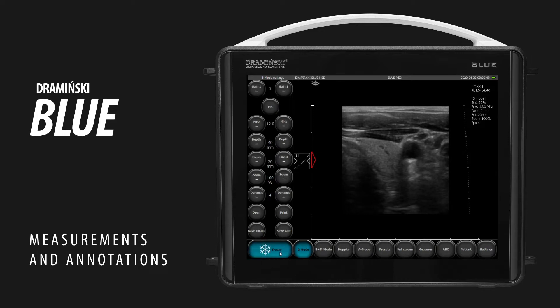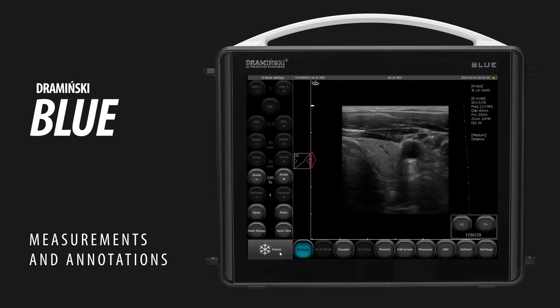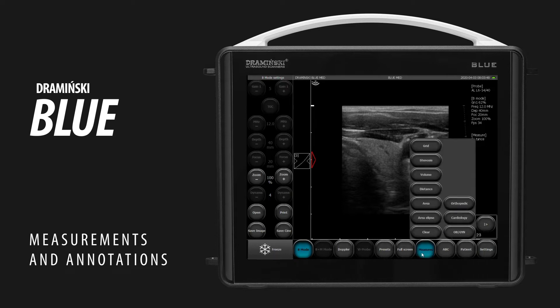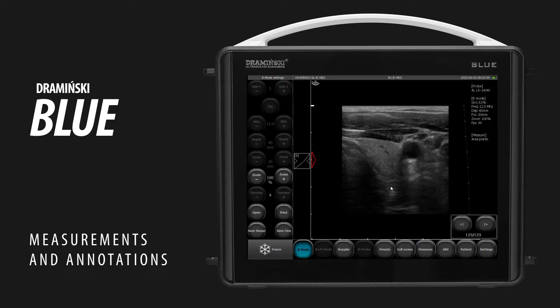To measure area, freeze an image and enter the measures menu. Choose area and draw a shape on the screen. The system will count the area and circumference of the shape.